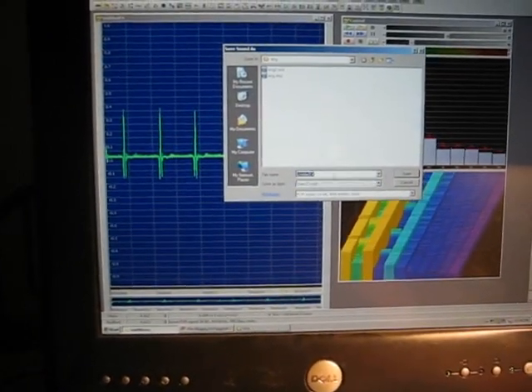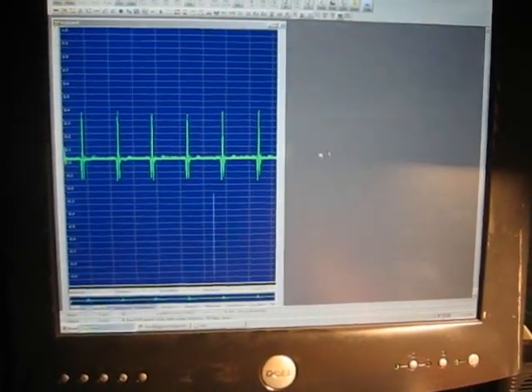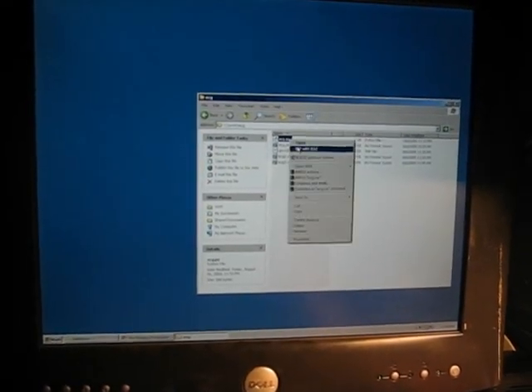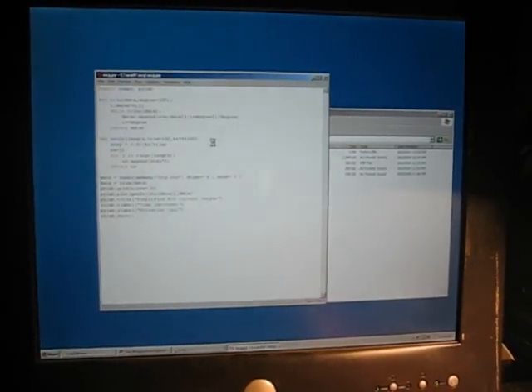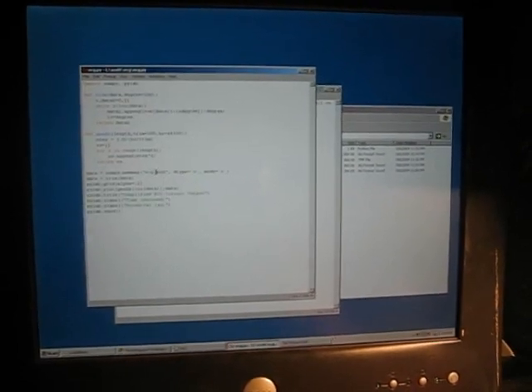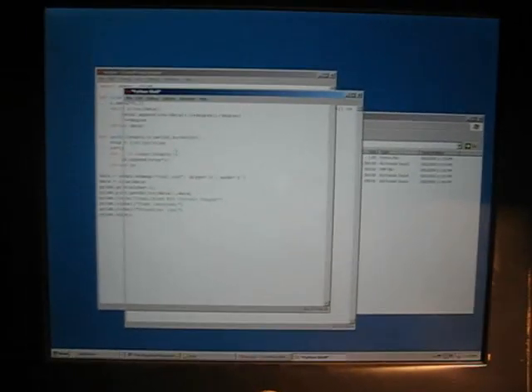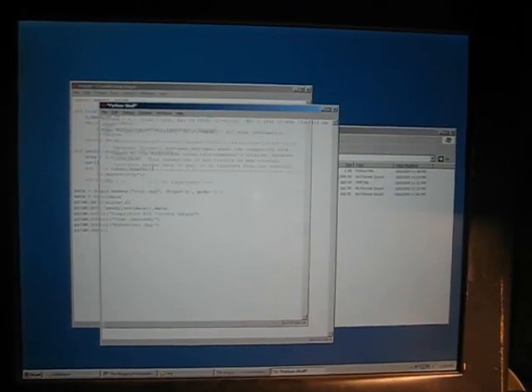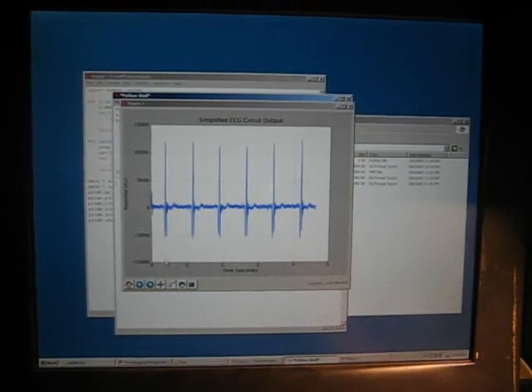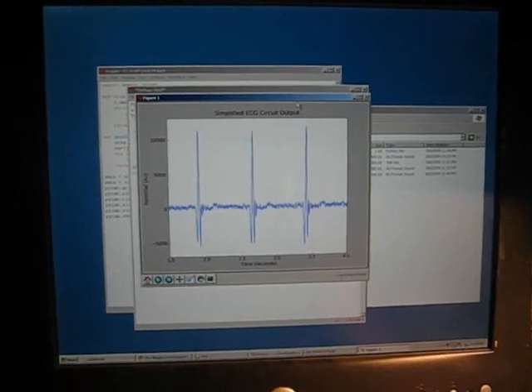I'm going to save it as a raw sound file. I will name it ECG3, and I can actually graph it with Python. I'll open up my Python script here, and I will adjust the file name to be ECG3, and I will run the script. And it's going to take just a second to load the first time. There we go. So this is the ECG that we just recorded. So look at that. Not too bad, huh?